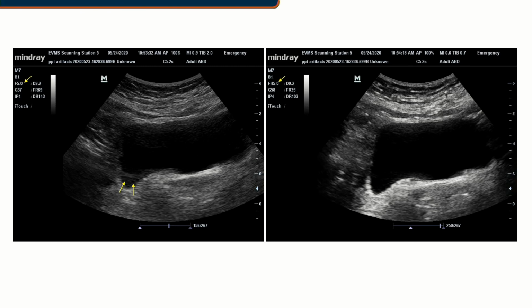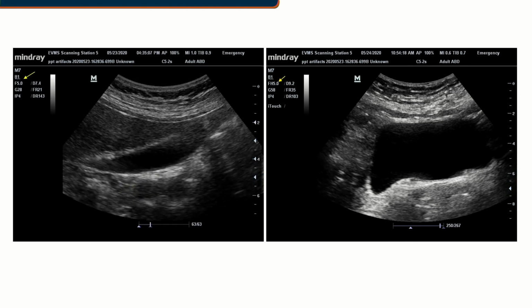So if we look at the image of a gallbladder here, there are a couple of things going on in here, but our grating lobes are down here at the neck. We have a number of other kinds of artifacts in the fundus of the gallbladder, and that's mostly coming from reverberation coming off of the peritoneal fascia there.